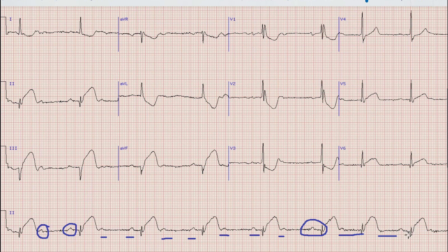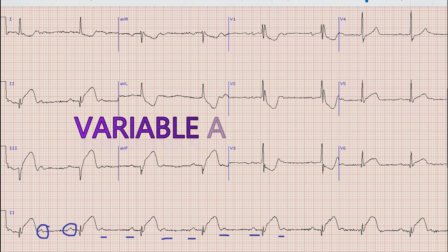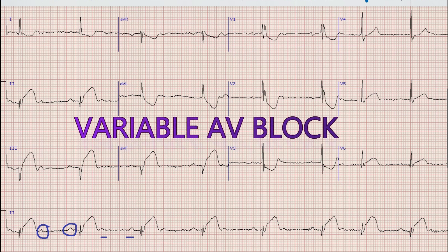After that there is a P-wave being conducted with a relatively short PR interval. So at the start of the rhythm strip there is a 2:1 AV block, while at the end of the rhythm strip there is Mobitz I AV block. So we will say that this is a sinus rhythm with variable AV block.